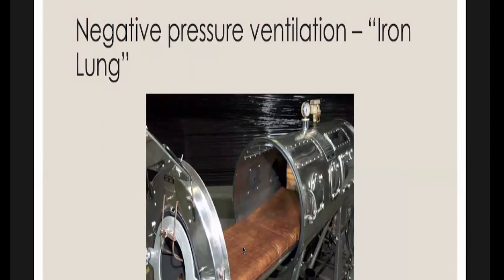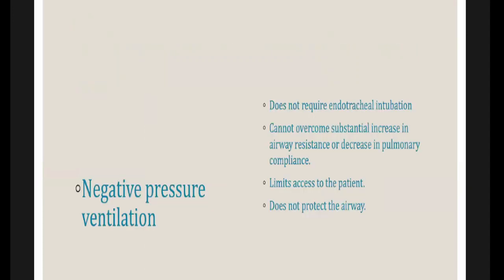You can see how crude it looks, and this is the chamber where they create the negative pressure. You can see the pressure regulators where they will set up. It now belongs to history, and it only has a historical value. Negative pressure ventilation has a couple of advantages as well.